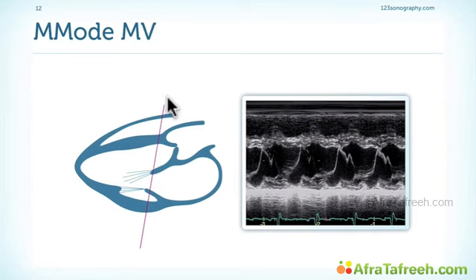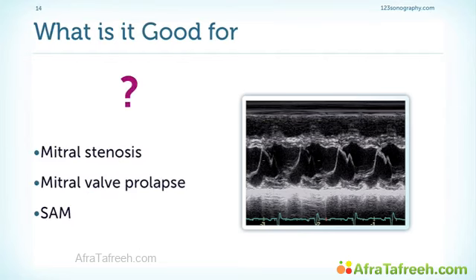But just to show you how an M mode of the mitral valve looks, you would now cut right through the mitral valve at the tip of the leaflets, and the image you get is a motion of the anterior leaflet, which has an M form. You see, this is the early diastolic opening and the atrial contraction or late diastolic opening, and the posterior leaflet will move exactly in opposite, with a motion downwards towards the left ventricle in the early diastole and also at the late diastole.